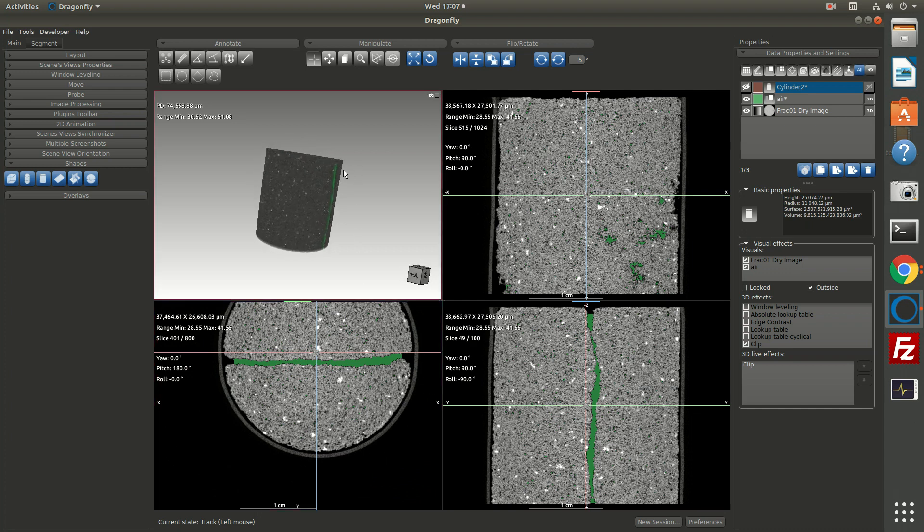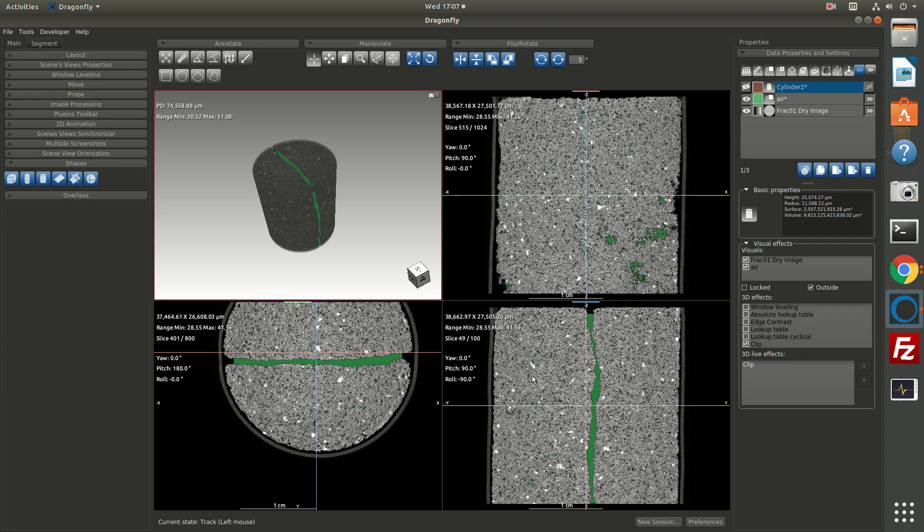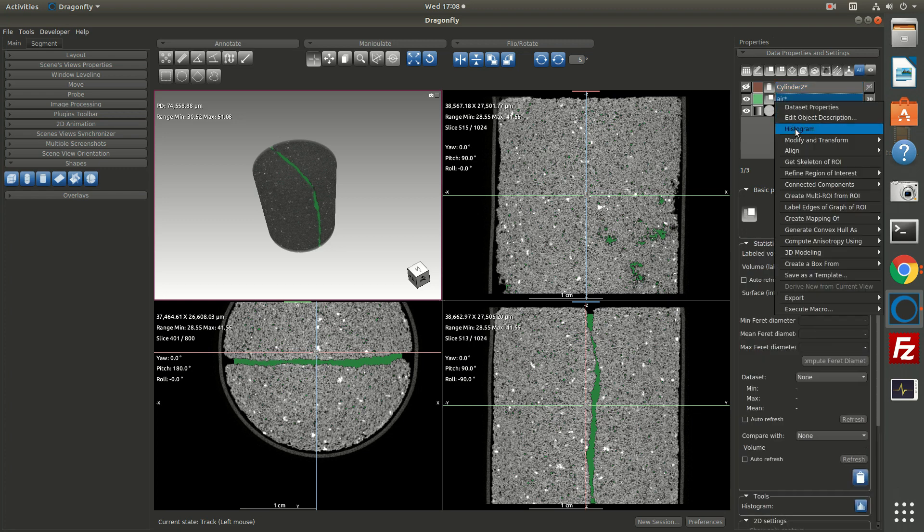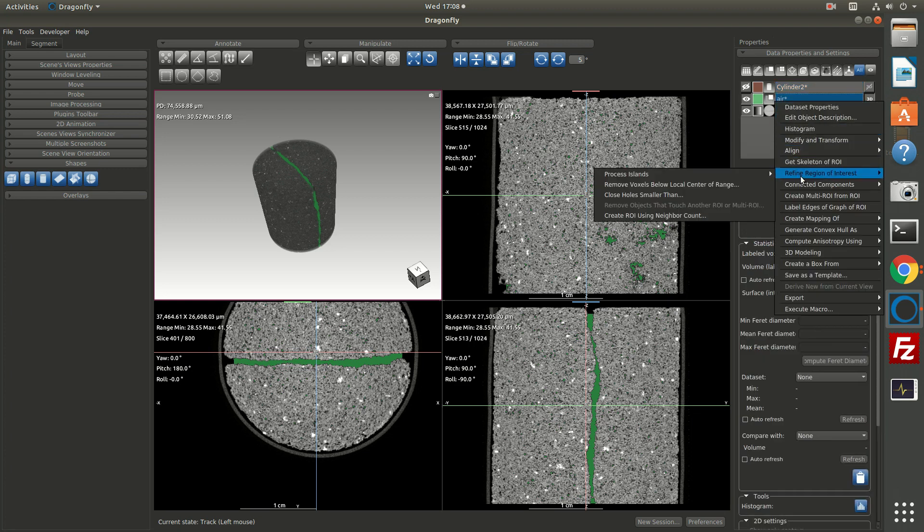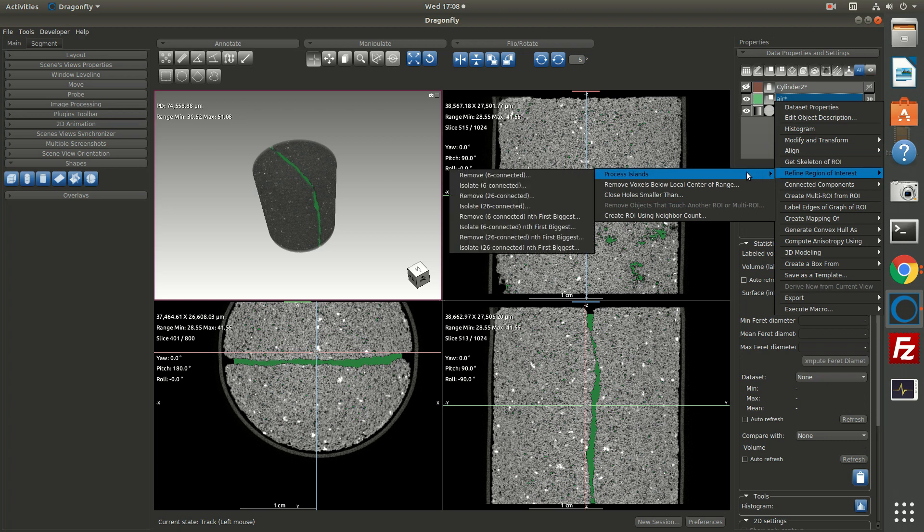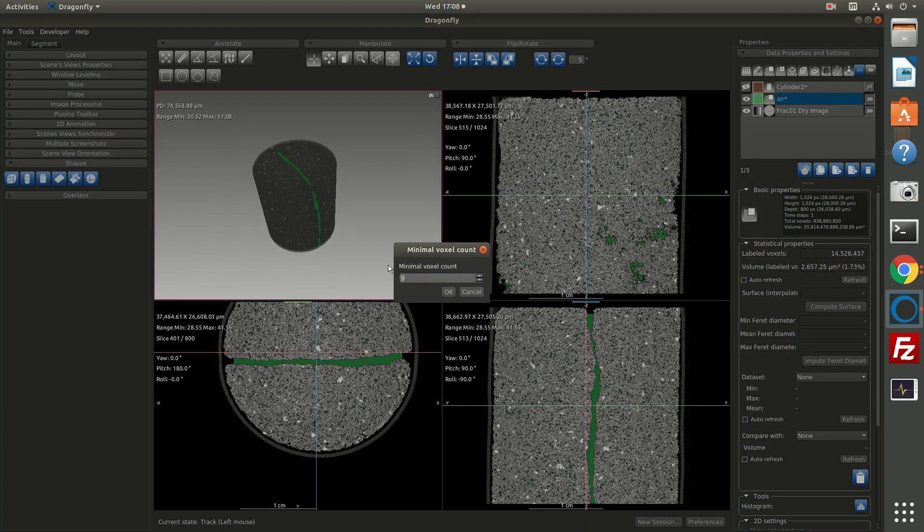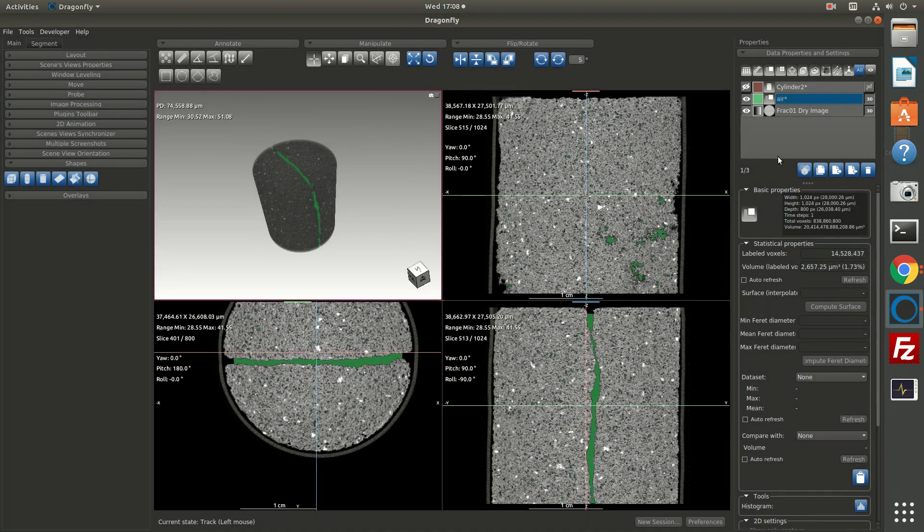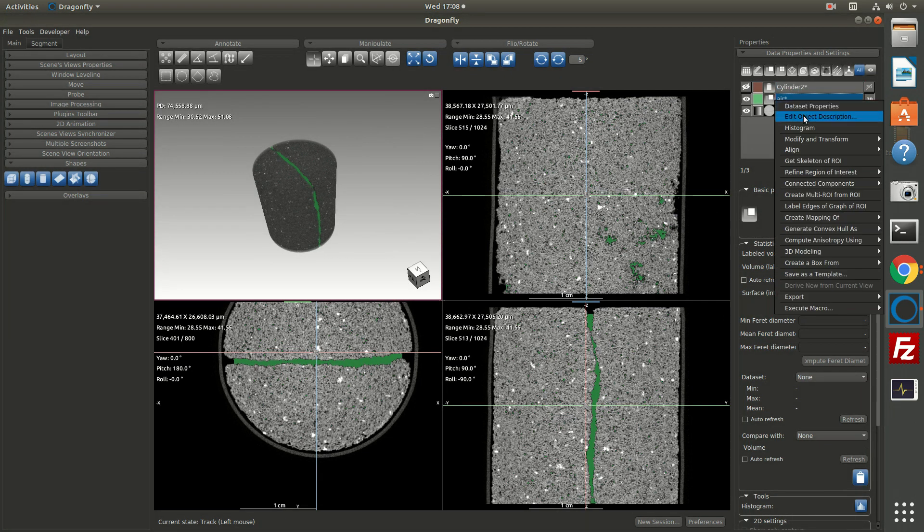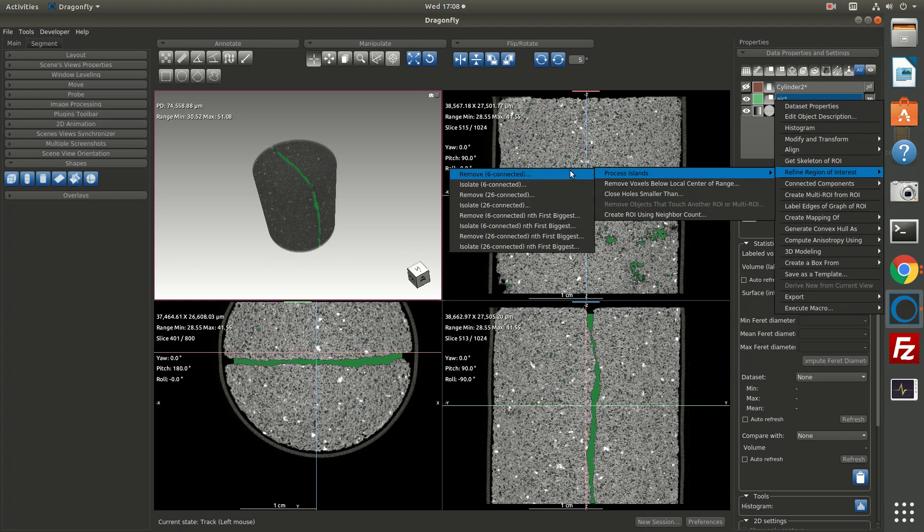Now from here, if I wish to extract out just the largest block of contiguous pixels, which would make up the fracture and exclude all of these small islands, one thing I can do is I can right click on air and I can go to refine region of interest, process islands. Now here I could click remove and say remove every cluster that's smaller than 100 pixels, for example. That's one option. Another option is instead of remove, you can isolate. And then if I selected 100 pixels, it would return everything that's greater than 100 pixels. Or sorry, it would do the opposite. It would keep everything that's 100 pixels and smaller.